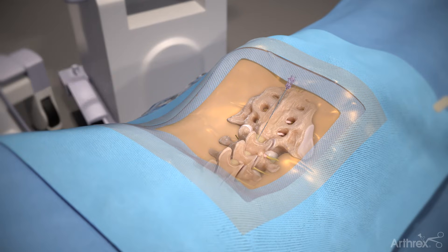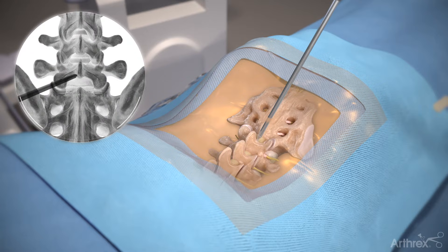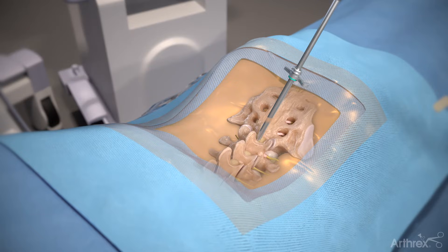Remove the stylet and thread a guide wire through the spinal needle's cannula. Then remove the cannula. Insert a switching stick over the guide wire. Palpate the spinal laminar junction with the tip of the switching stick and use fluoroscopy to confirm the correct position of your cannula. Insert the cannula over the switching stick and then remove the switching stick.